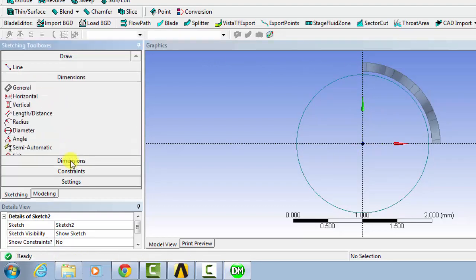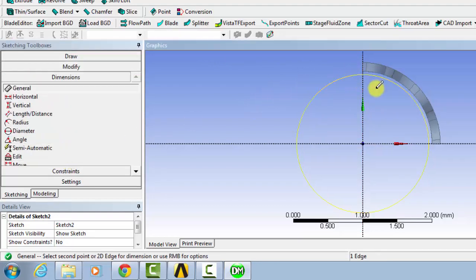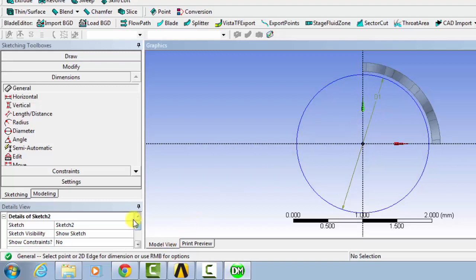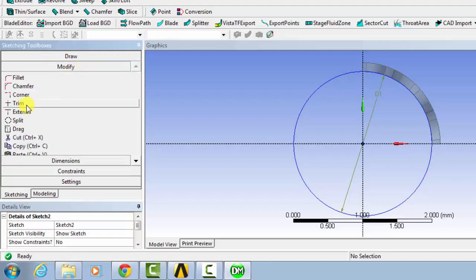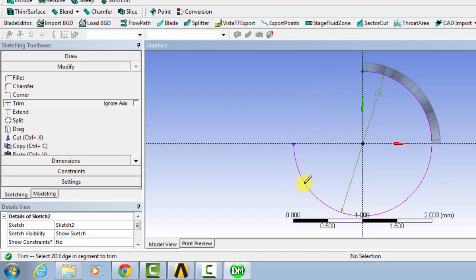From here we'll create a dimension, and we'll define the radius or the diameter of the circle to be 1.995 millimeters. So it'll be just barely less than the stent. From here we'll go to Modify and then Trim, and we'll trim away the excess parts of the balloon. Because of symmetry, we only need this part of the balloon.